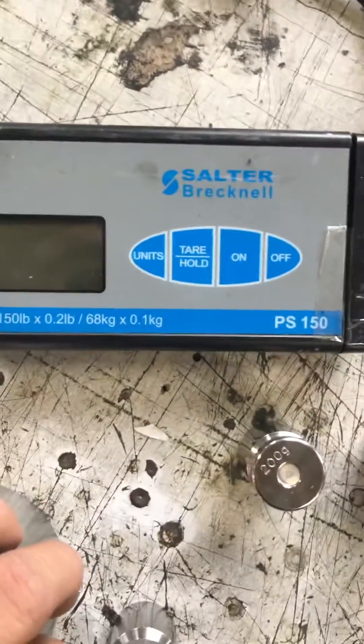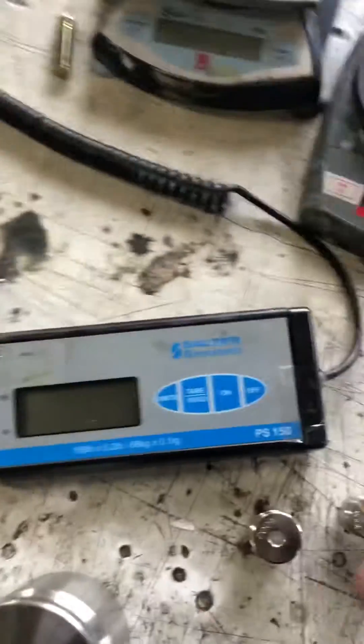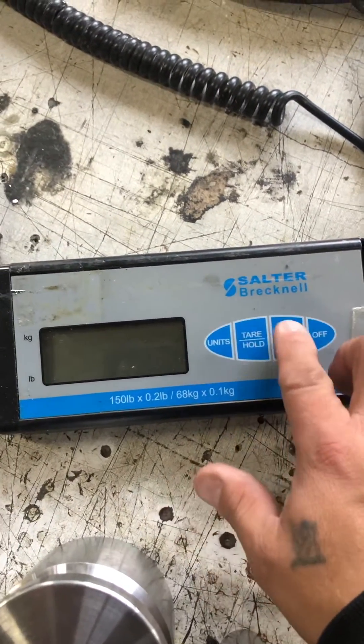Calibration adjustment of a Salter PS150. Wireless must be off — it's got to be off.